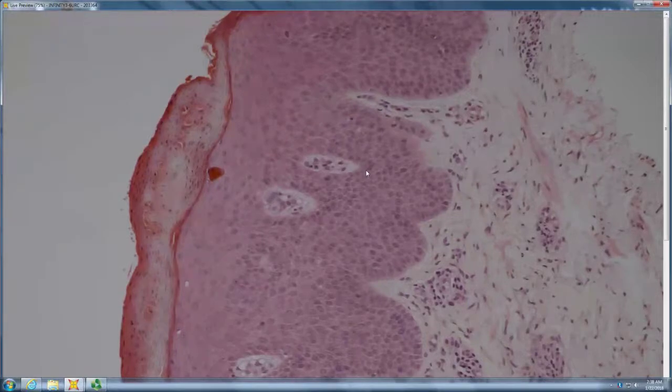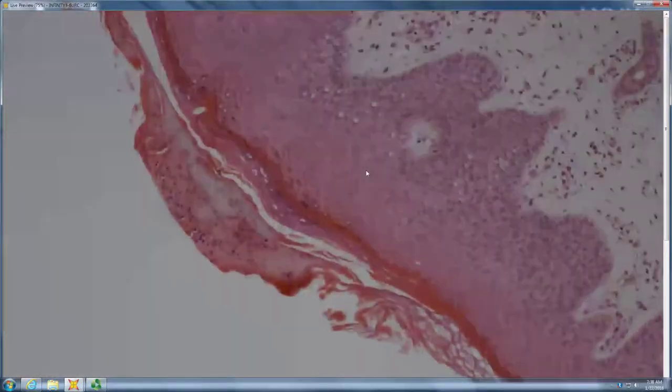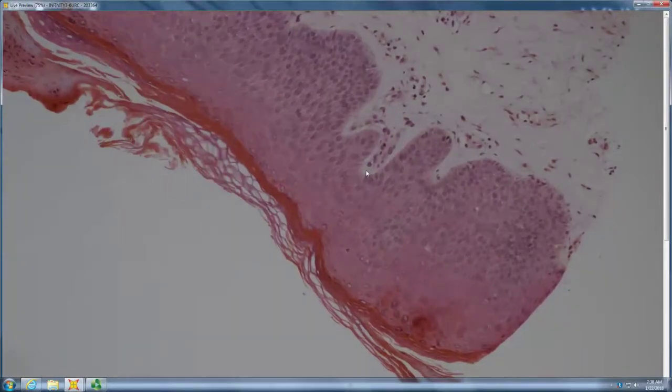So all scale is parakeratotic except for furfuraceous scale of tinea versicolor. And right in this zone is where you're most likely to find the hyphae. So that basket weave ortho on top of compact red is a helpful clue for dermatophytes.